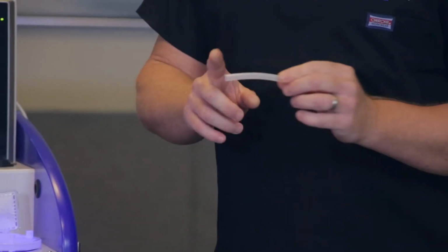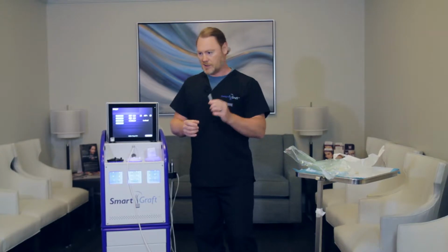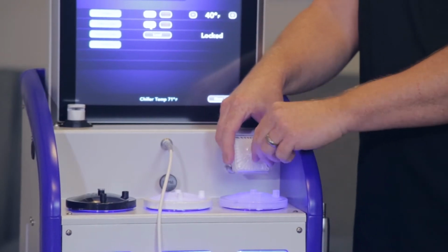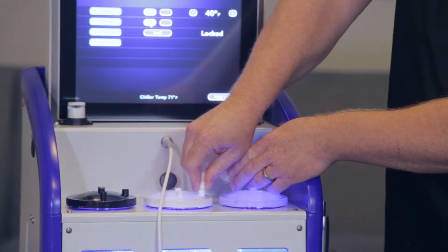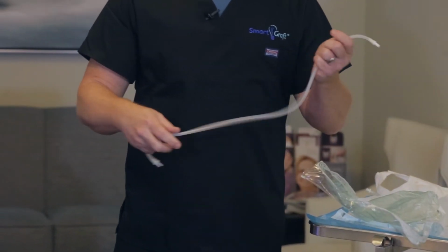So the first tube that I like to put on is the one to the filter. If you notice, it does not have a nozzle tip on it, and this will connect right to the filter. It just slides on, does not have to go on all the way. Now this nozzle tip will go right into the next hole, right to its right-hand side, and that's its proper location.